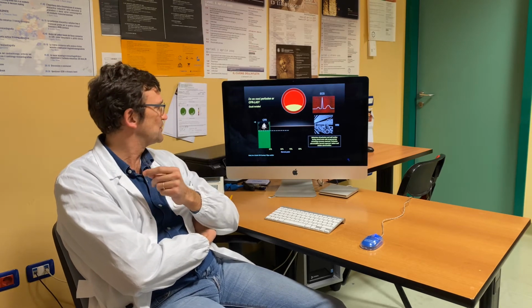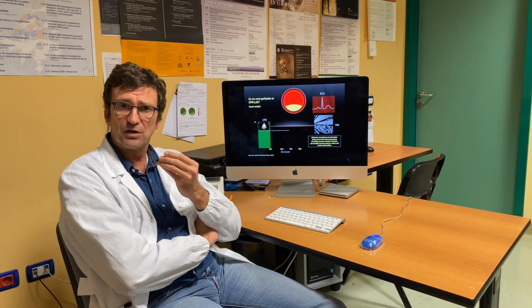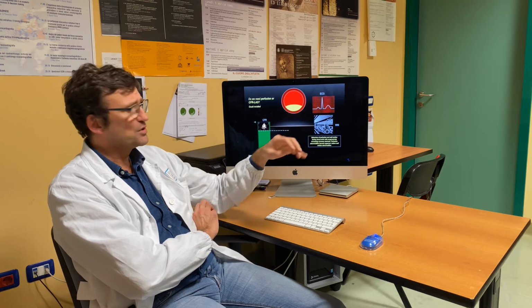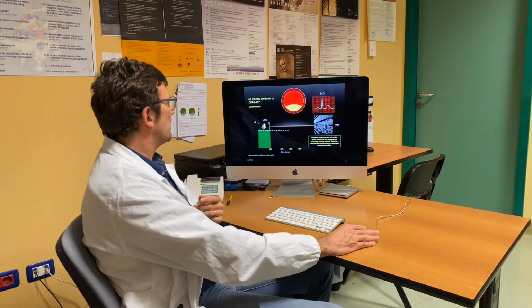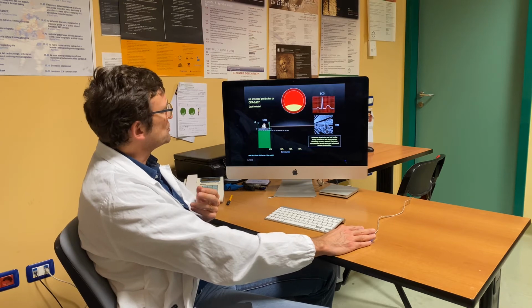We did some also. The very concept of coronary artery disease, stenosis, and the grade of stenosis is that when you have a very mild plaque, which is clearly not obstructive, you have a normal CFR, maybe more than 2, maybe 3, and normal perfusion and normal wall motion.